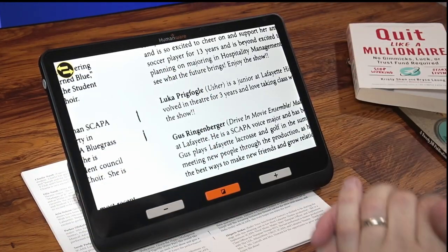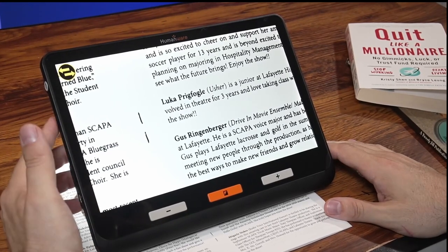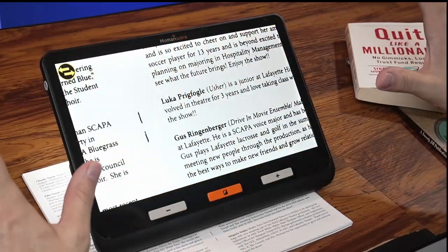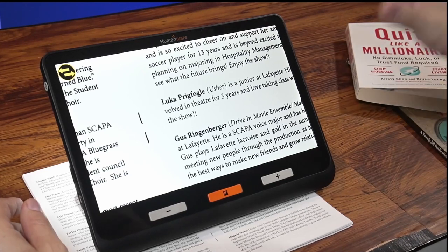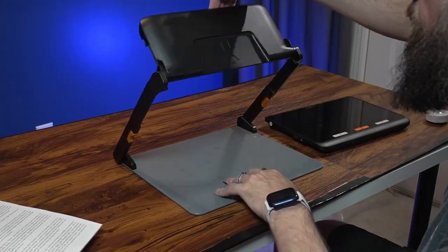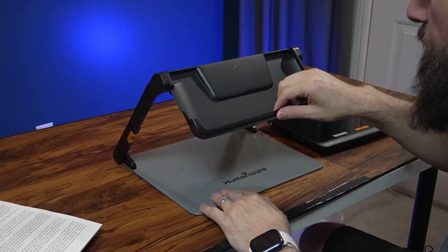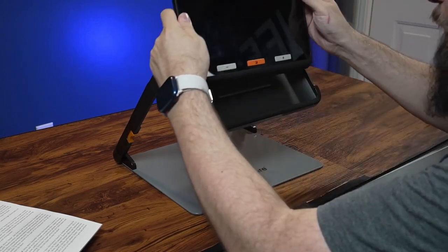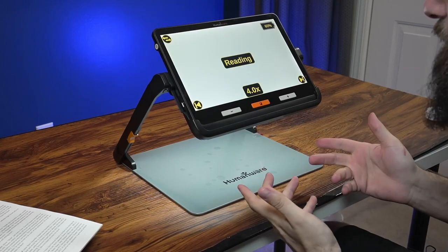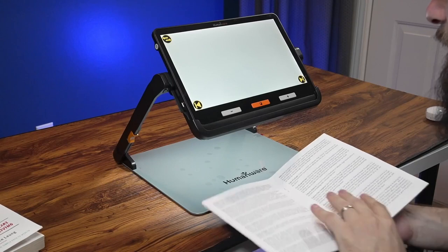Those are the basic operations of this digital magnifier. You also have the option to connect it to an external monitor via HDMI to display the image on a much larger screen. Now let's check out the desktop stand. It's very easy to open, and whenever you drop the Explore 12 into it, it automatically detects that it's docked and turns on — lights come on, everything.